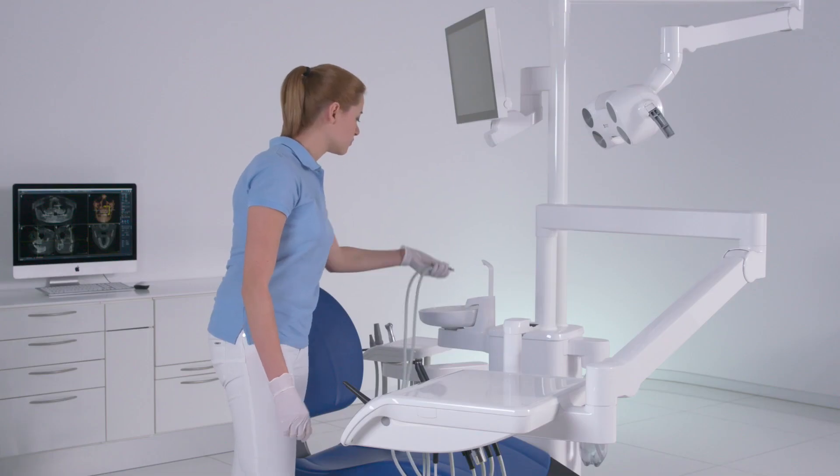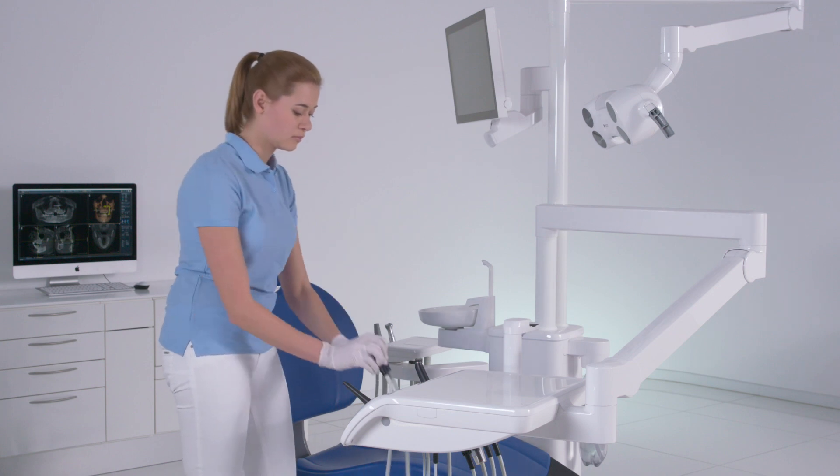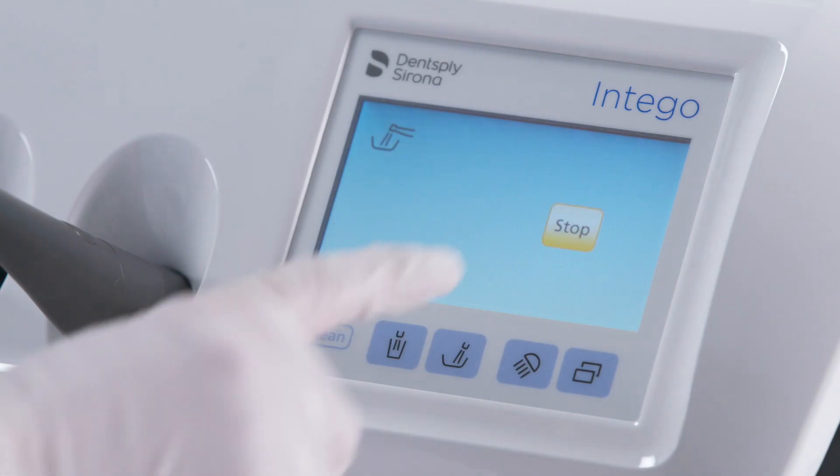Hold the instruments over the cuspidor. The instruments will be flushed for the duration of the set time.